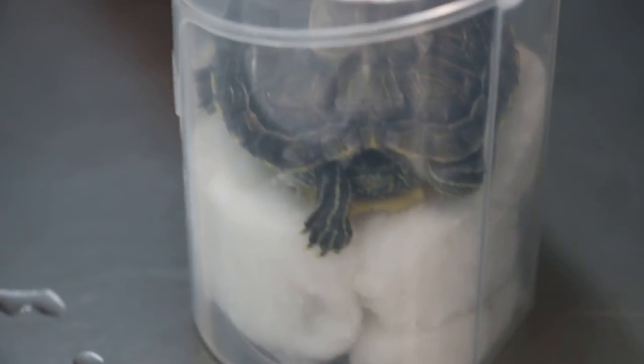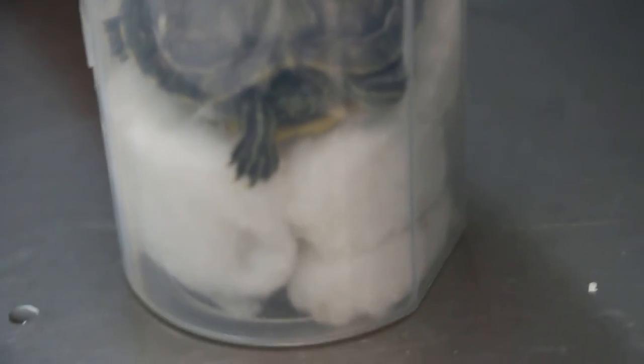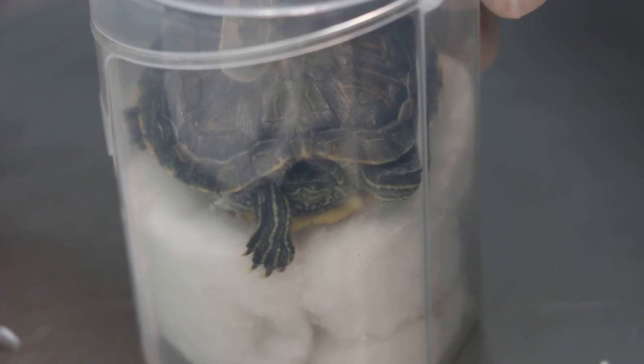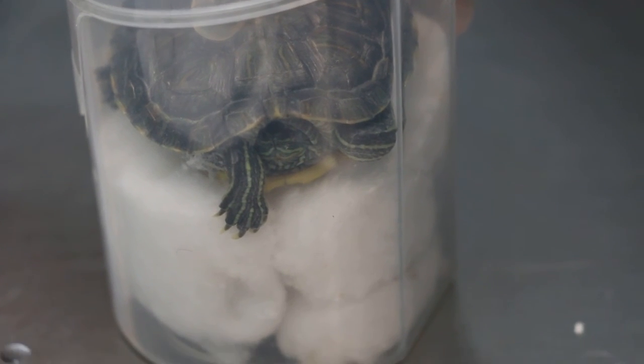Some terrapin is easier. Where is the head? The head is on this side. No, the gas goes to the head there. It's more than one, two minutes actually. Now it's 3:05.